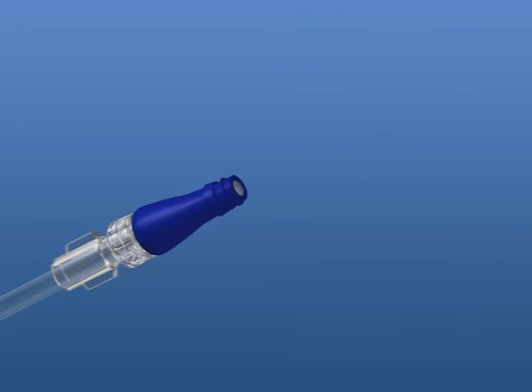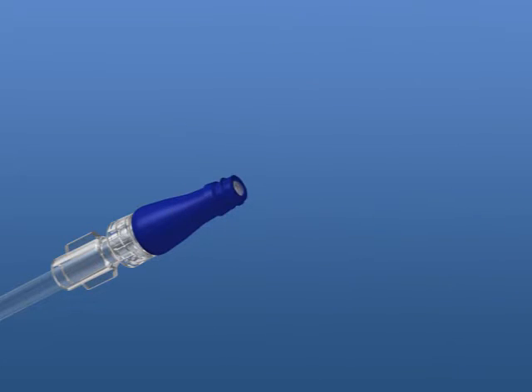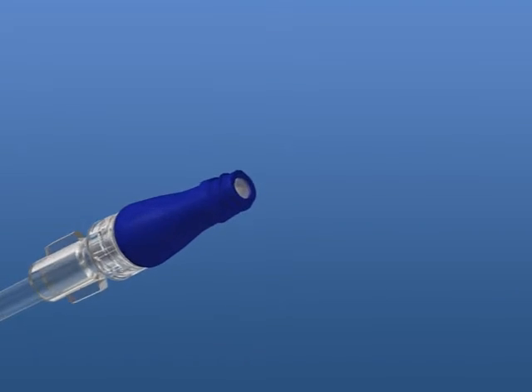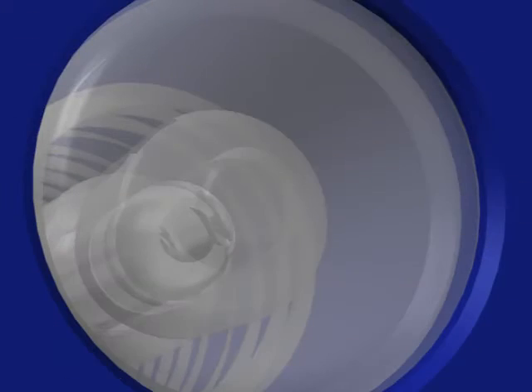To access the Microclave, first swab the top of the connector with alcohol. When the Microclave is properly disinfected using a swabbing technique, microorganisms are removed from the access site of the split septum.